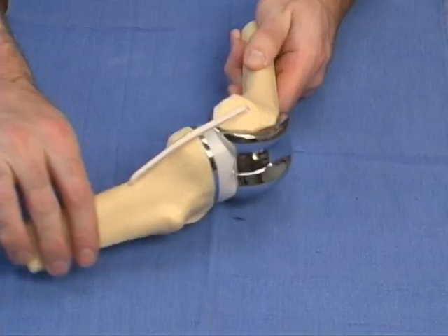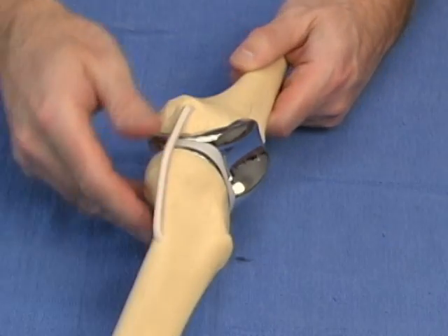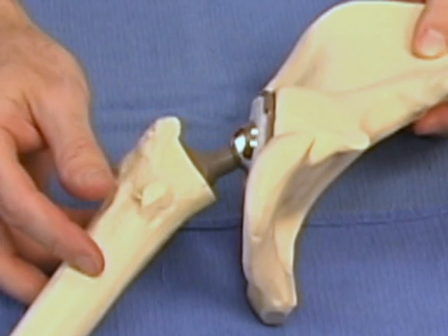Total joint replacement is an effective means of treating badly worn arthritic joints. Metal and plastic components are inserted into the painful joint, often decreasing pain and improving function. Here's an example of a knee prosthesis. Precise instruments are used to insert these components. The same is true for a hip prosthesis. The patient is now walking on metal and plastic instead of the painful joint. In select patients, minimally invasive techniques can be used.